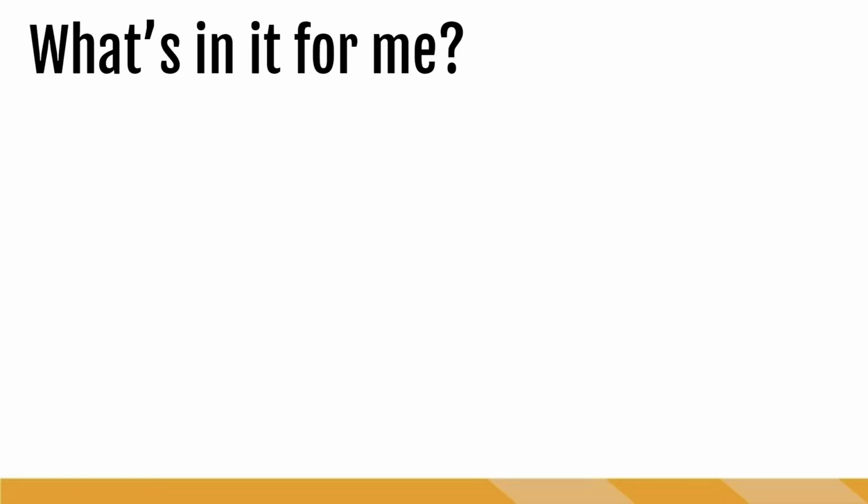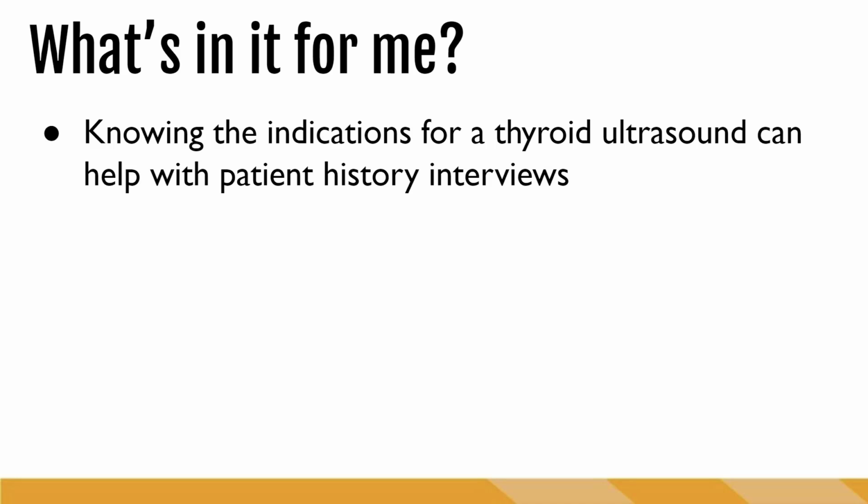So as a sonographer, it's probably relatively obvious why we need to learn the ultrasound appearance of thyroid tissue, but a big part of it is also knowing what the indications are for a thyroid ultrasound. So when we're doing our patient history interviews, we can start to come up with some differentials in our mind, what we might come across during the exam.